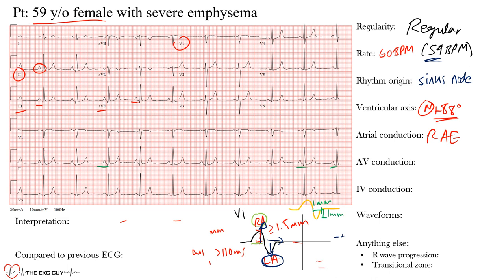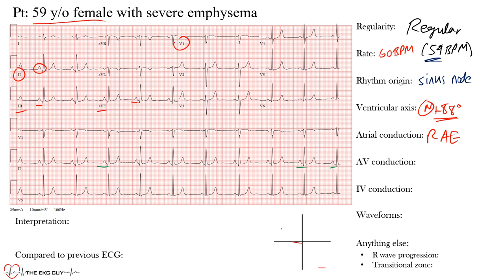Next is AV conduction, focusing on the PR interval. Is it prolonged? Are there any dropped beats or AV block? In this case, AV conduction is normal: every P wave is followed by a QRS complex, there are no dropped beats, and the PR interval — normal in adults between 120 and 200 ms — was 146 ms here, which is within normal limits.